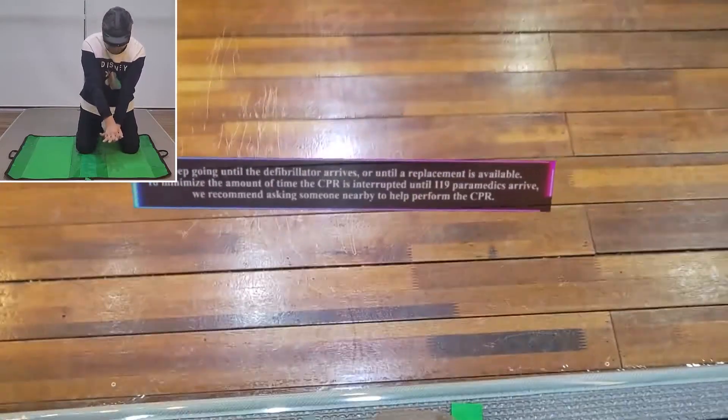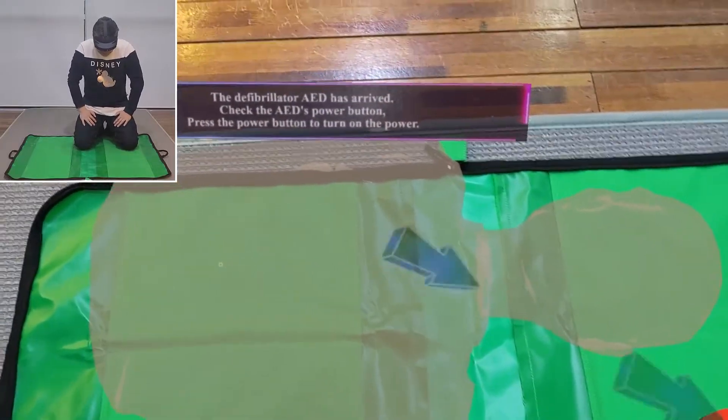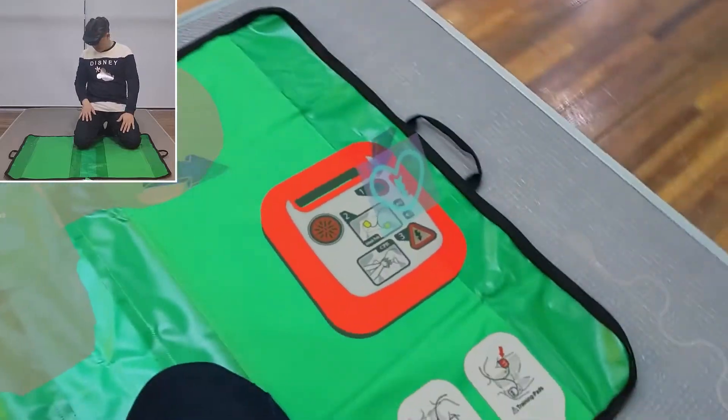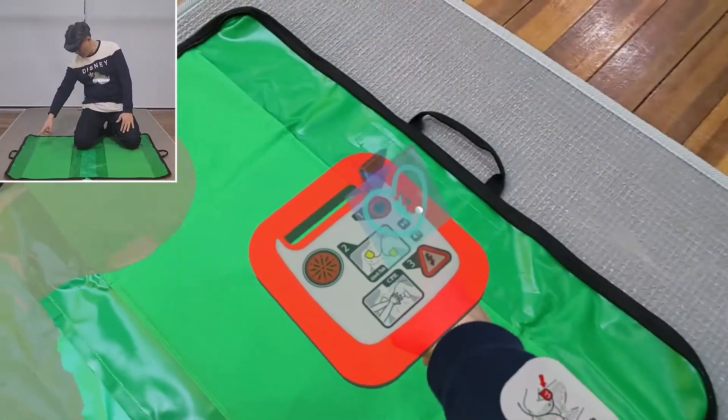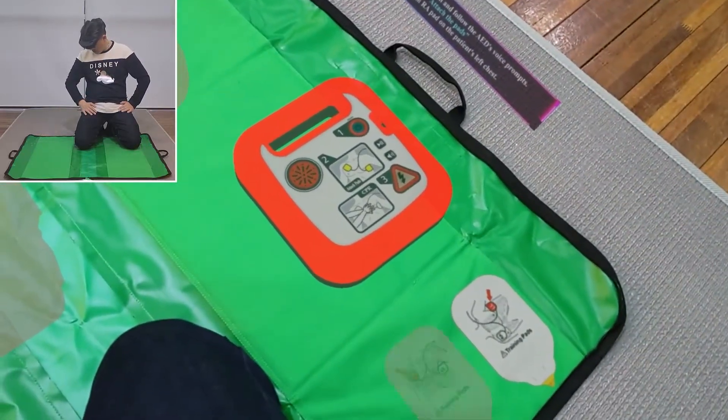The defibrillator AED has arrived. Check the AED's power button and press it to turn on the power. Once powered on, stay calm and follow the AED's voice prompts.